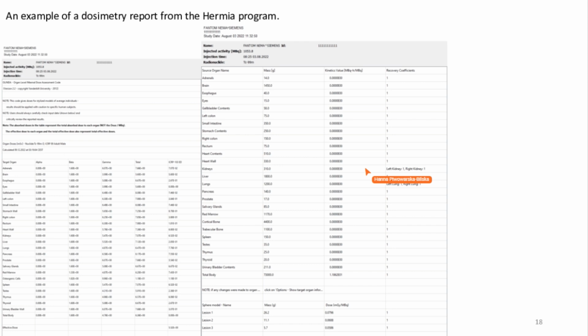Several years ago, for the first time, I generated a dosimetry report. I was learning how to use the dosimetry software when I was quite surprised because this looked like a very serious document, lots of data of the patients, many numbers generated by me, but they were generated accidentally. If we use dosimetry programs that are not calibrated, they can distort the results.